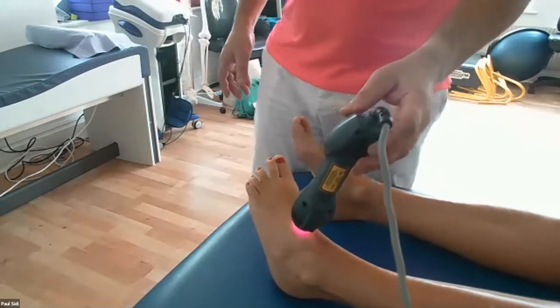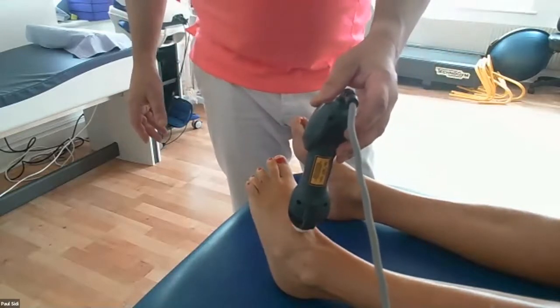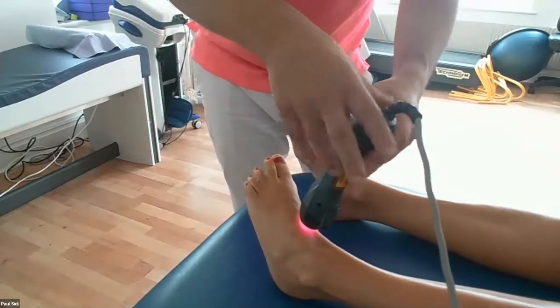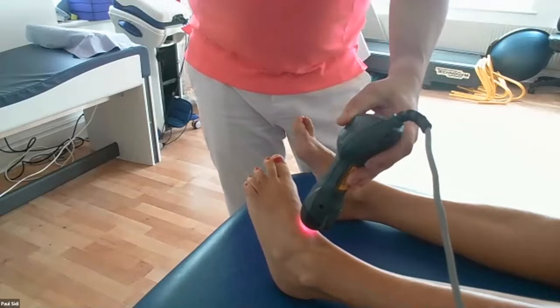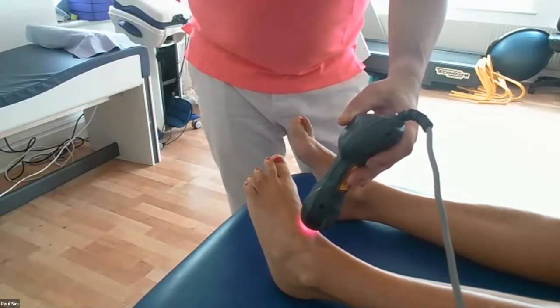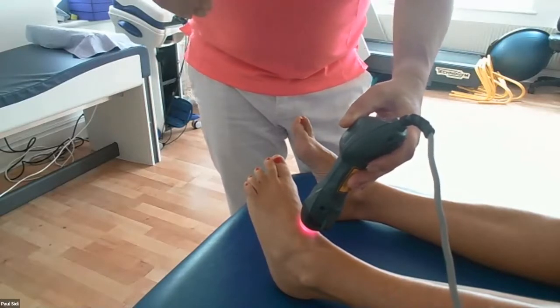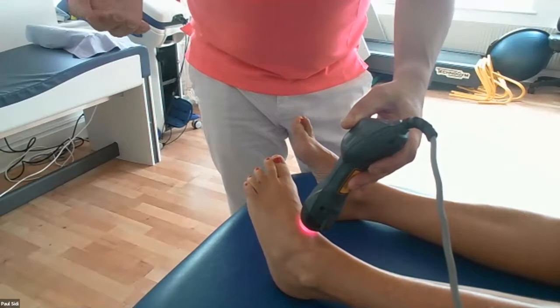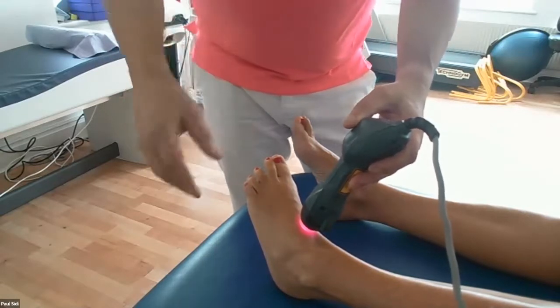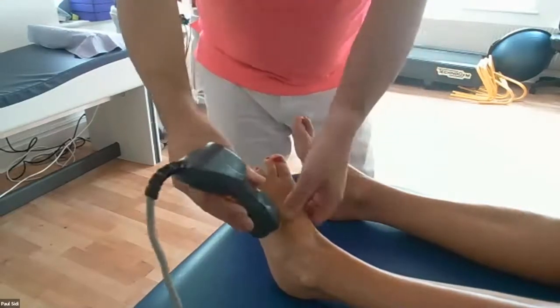I will call her the next day and say, how is it? She'll say to me, do you know what, I'm feeling so much improved. Or she'll say, no, it's actually slightly worse. And I'll say, well, hang on, you said you had this a long time. No, it's just happened this week. And then I know I've been an idiot because it's an acute situation and I put the very high power in there. So literally, it just stops itself.